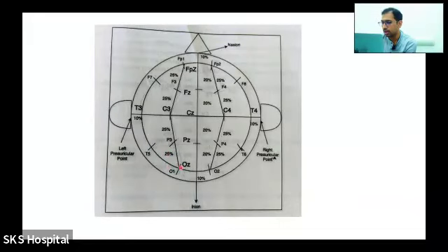So now coming to the occipital, that is O1 is here. From O1 to C3 and C3 to FPZ, you just start a straight line, then divide it into half, which becomes 25, 25, 25%. Say for example, from here till here, if it is 20, then each distance would be 5 centimeters, 5, 5, 5, 5, which becomes 20 on either side. Now we have found out the C3 and C4.